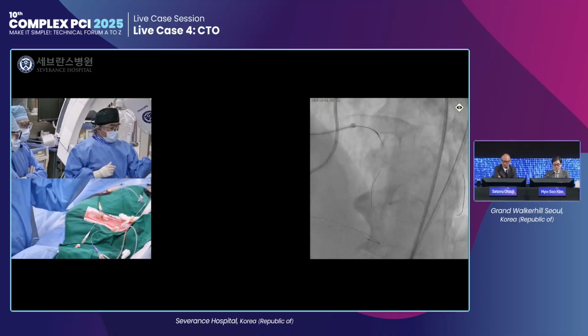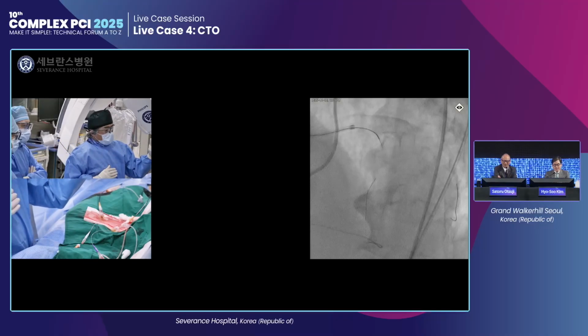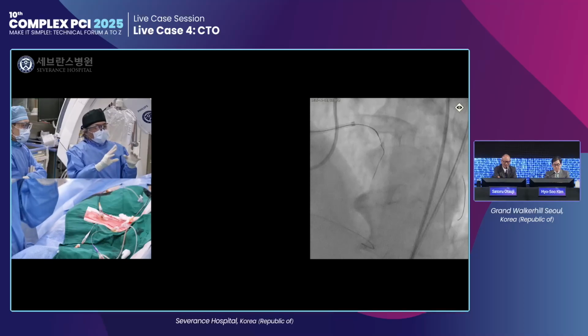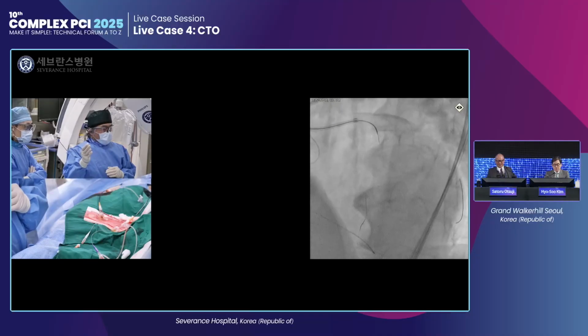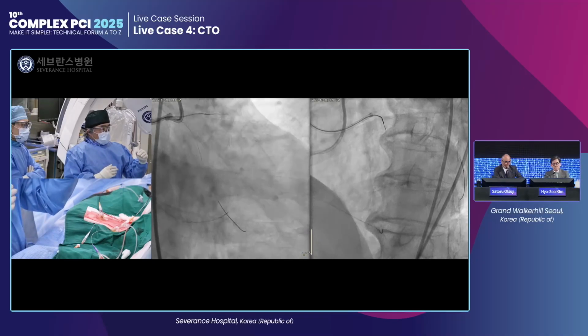No, this was another one before, right? You are showing us the image. Oh, really? Before, yeah. So, BK, why? And then I changed the microcatheter. You put the microcatheter into the LAD, right, 10 minutes ago. That time you were almost successful.